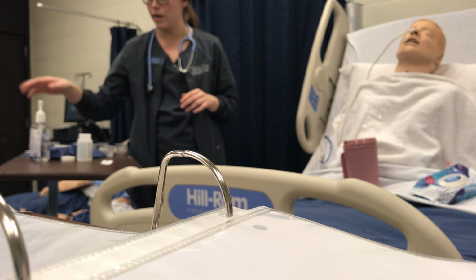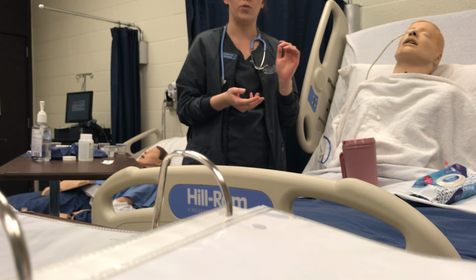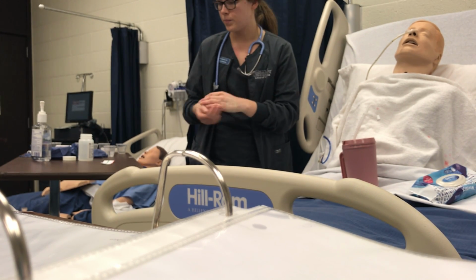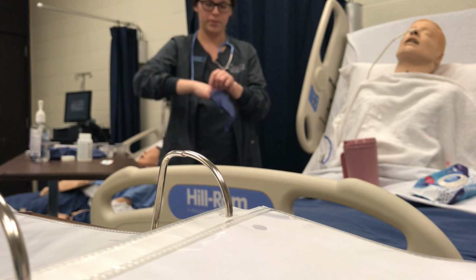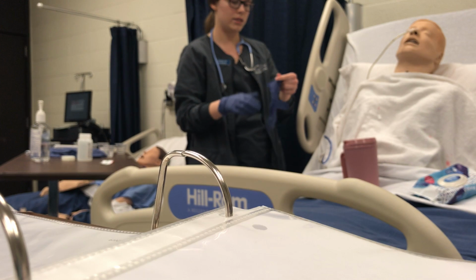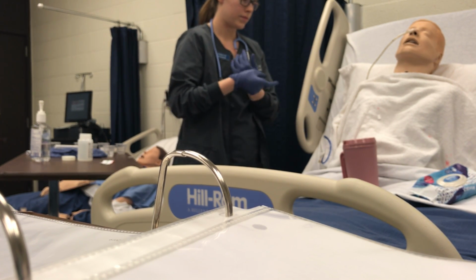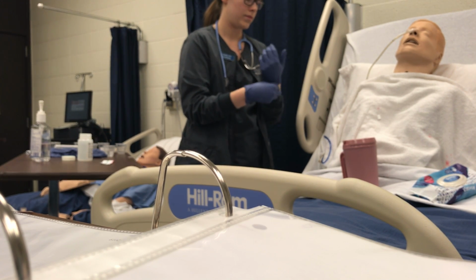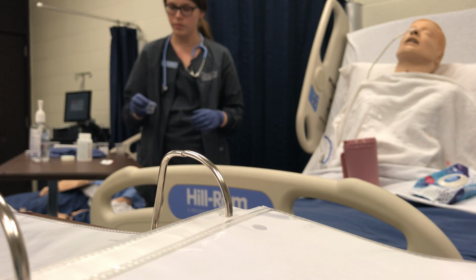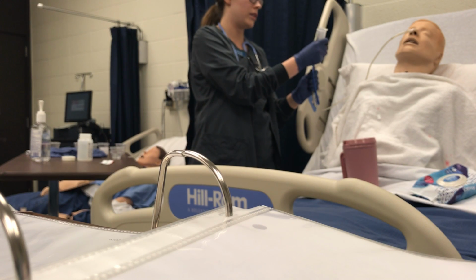And then I would also listen for his abdominal sounds and make sure he's not experiencing any kind of nausea or vomiting at the moment. And once I checked all of those, I would go ahead, I would put my gloves on. I would have my towel ready, have their Kleenexes ready there. And before I would do that, I would want to flush it with 10 mils of water just to make sure it's all clear and ready to go.